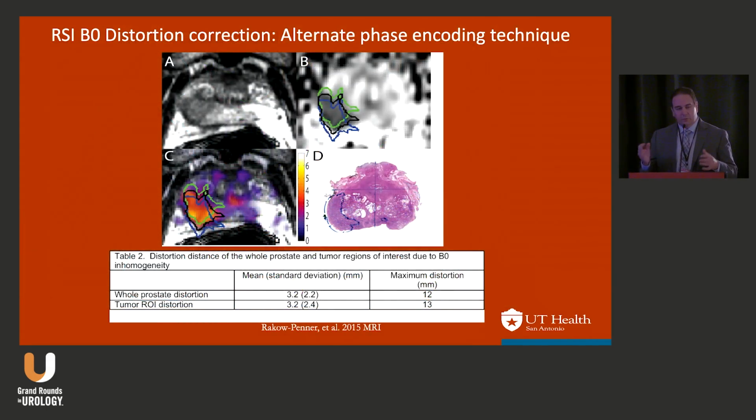And there's one small component about MRI that kind of gets overlooked. When we have a B0, we do this phase encoding. Your tech will just pick right to left or left to right, and there's this little button on there. When they do that, what they're doing is imaging different waves, different sequences over time.